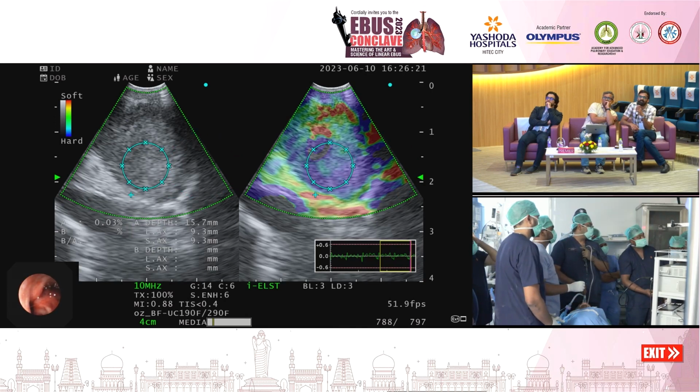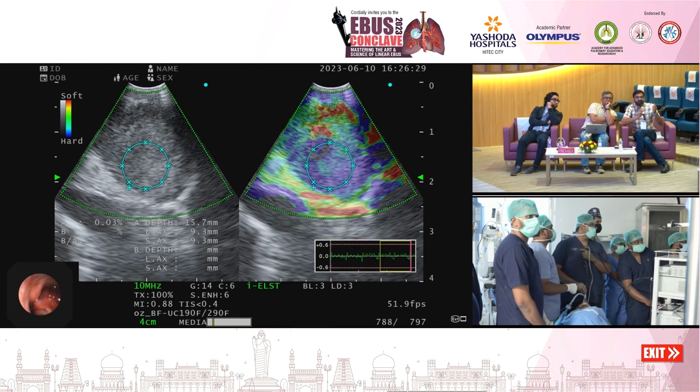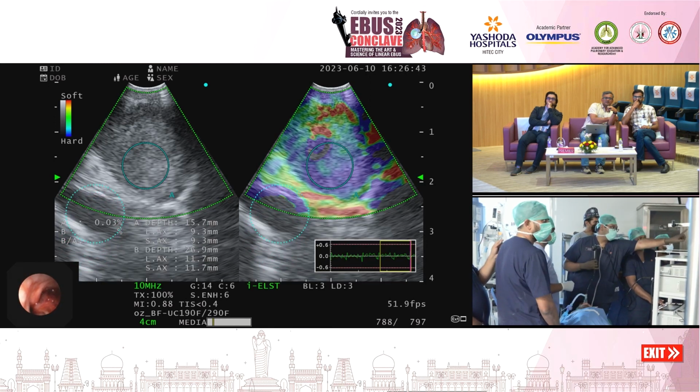Like with other imaging appearances, this is also non-specific. Exactly. This is more often used for pancreatic lesions, I would say. In EBUS, there is little data for elastography. It will increase the likelihood, but it can never replace TBNA. TBNA is the gold standard.